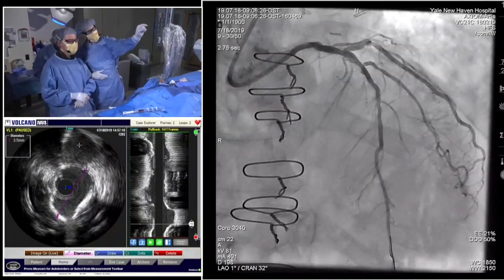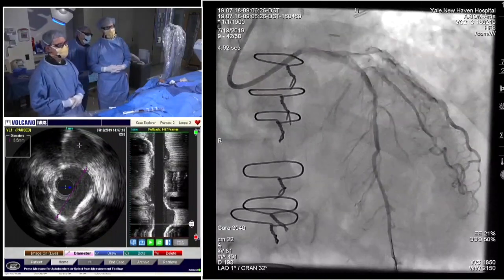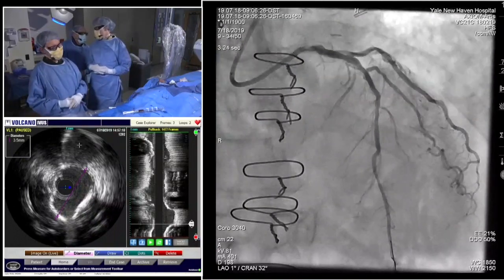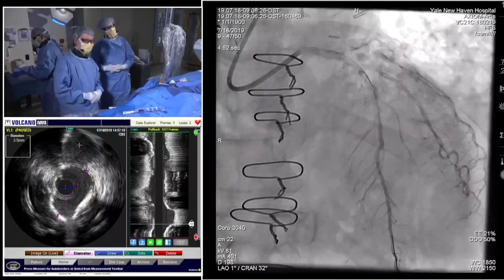Between those two diagonals. So, yeah, you guys can see here the IVUS image, the crosshairs are in the diag there. So this is right adjacent to where that big diag comes off. Yeah. It's pretty big up there. So we're going to put a smaller one distal and then take a nice long one, big thing proximal. That sounds like a good plan.